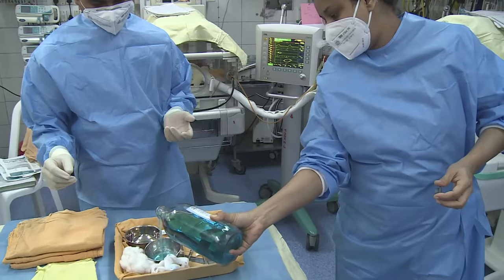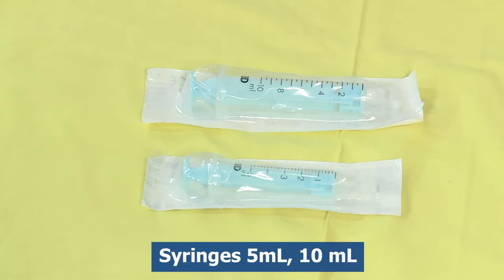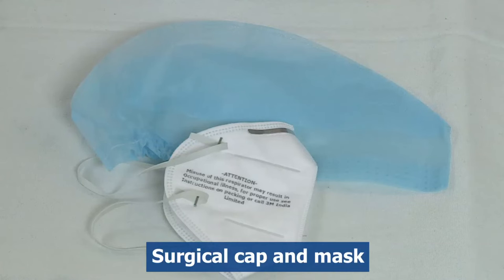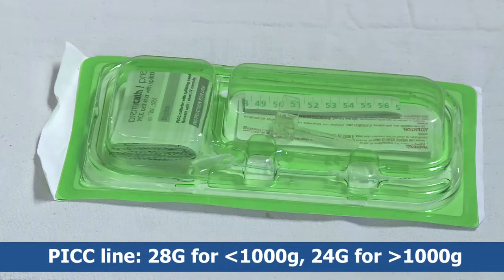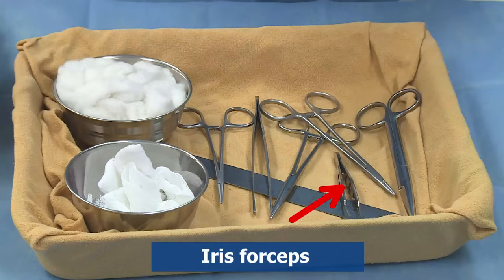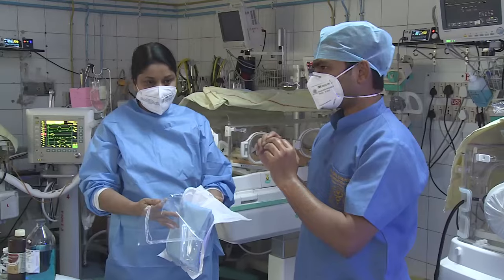For PICC insertion, the articles required include spirit and betadine, gloves, 5 ml and 10 ml syringes, sterile gauze, sterile gown, surgical cap and mask, normal saline, a PICC line — 28 gauge for less than 1000 grams, 24 gauge for more than 1000 grams — and a breakaway needle.